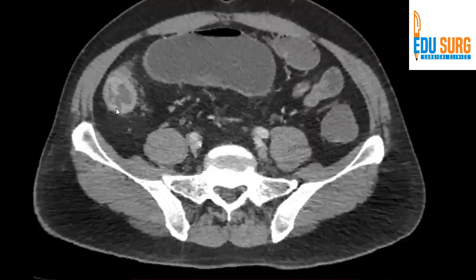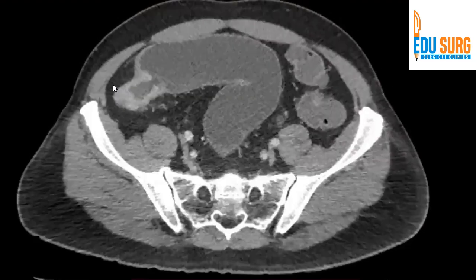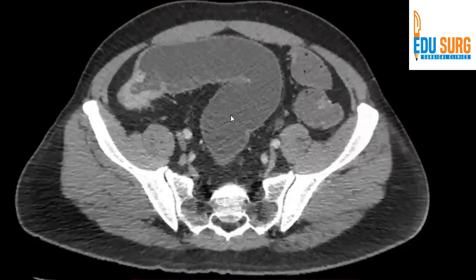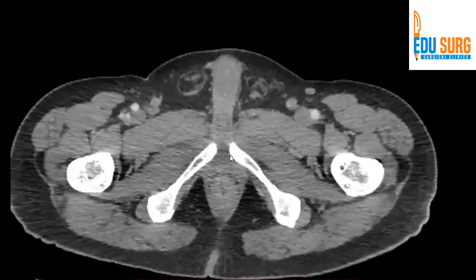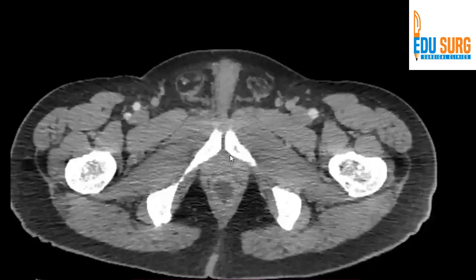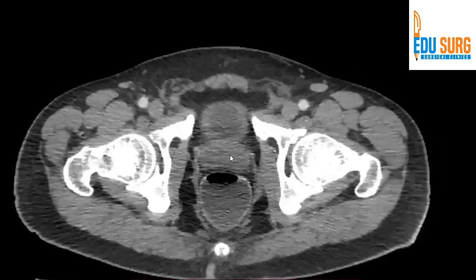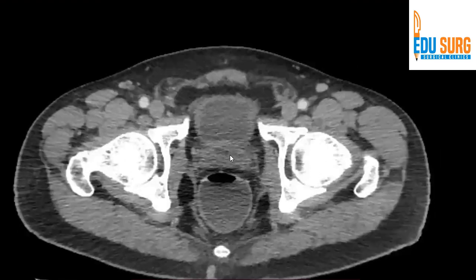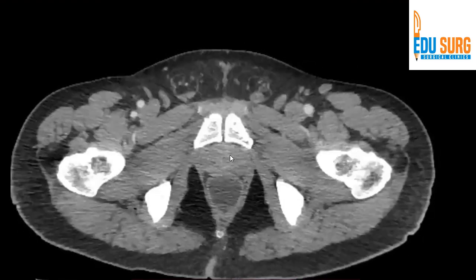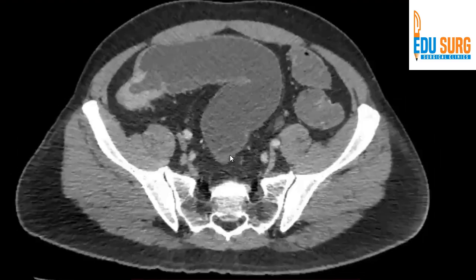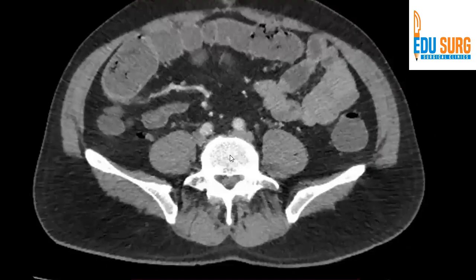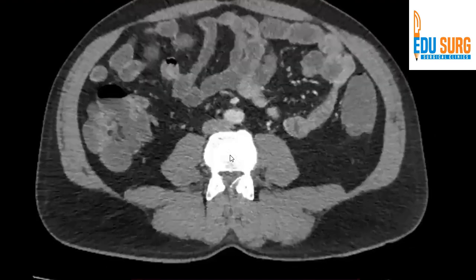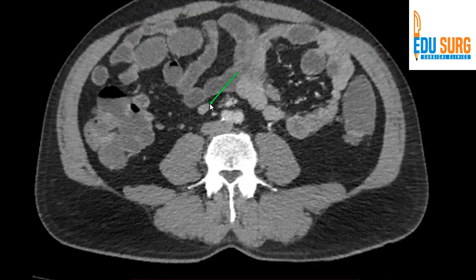And there you start having the thickening with some perilesional stranding and probable nodes — that is the sigmoid. Then going down the rectosigmoid, the rectum. So one finding is a lesion in the sigmoid. I will show it in the coronal also. But there are some important findings that I don't want you to miss in this scan. If you look at it closely, there is one very important finding, and that is this lymph node.